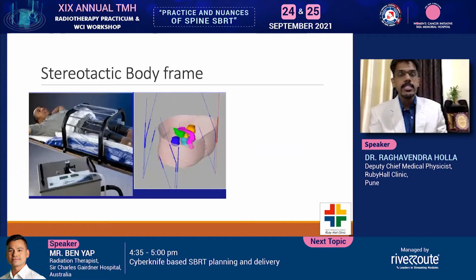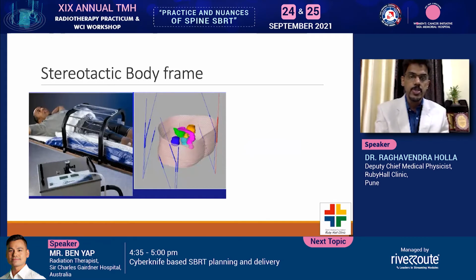There is also the body frame or frame-based stereotactic system, which is a little cumbersome to use. If you have a very good linear accelerator and a 6D couch, then I don't really find any way of using this, because the 6D couch does a lot of things. One of the issues we used to face is that the patient and the localizer are not in touch, they are separated.